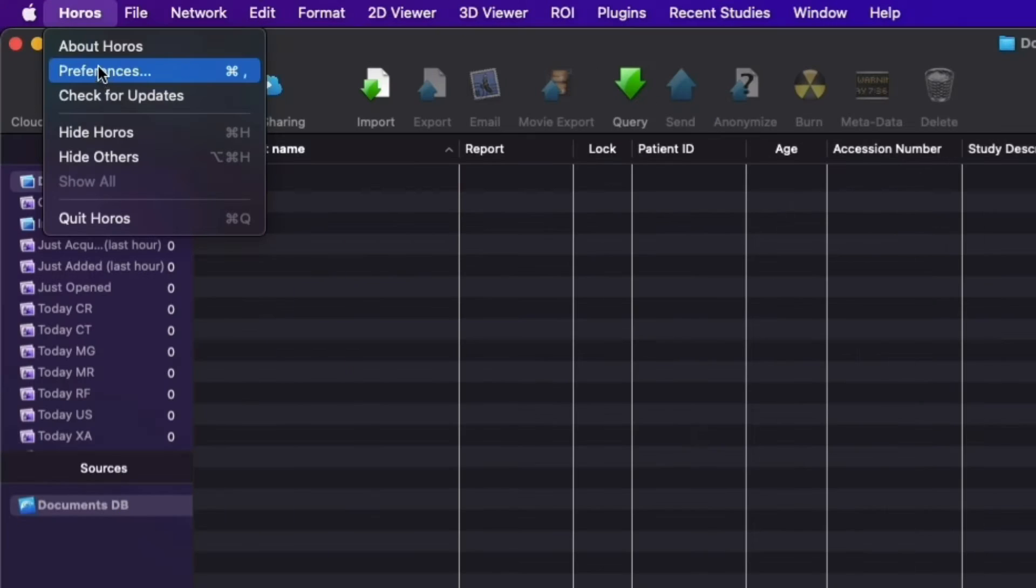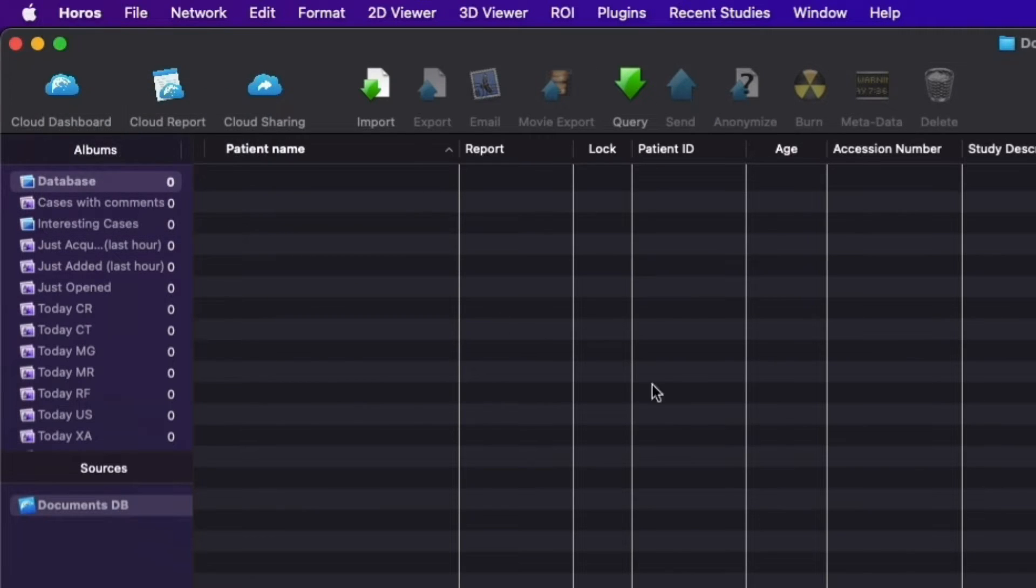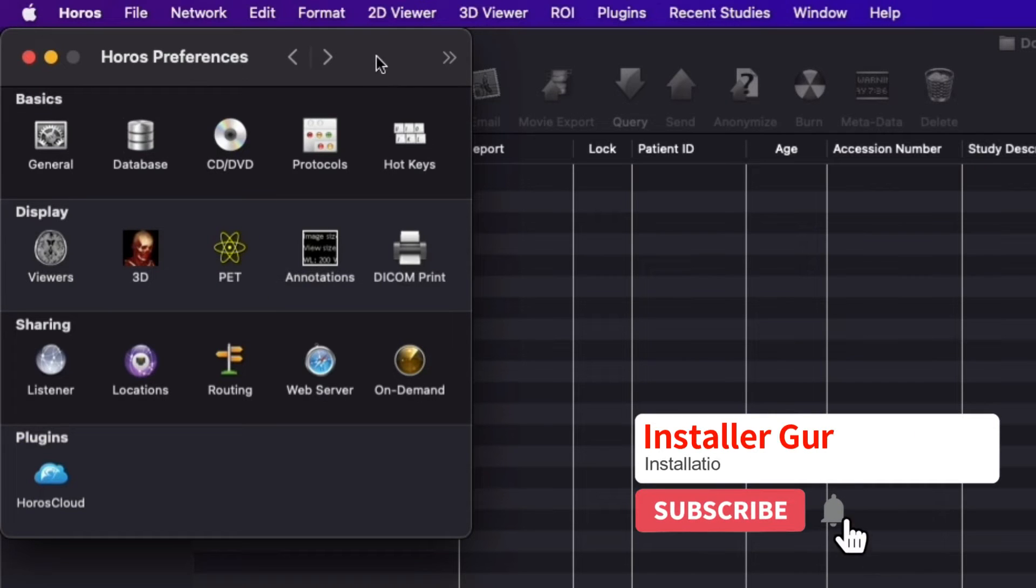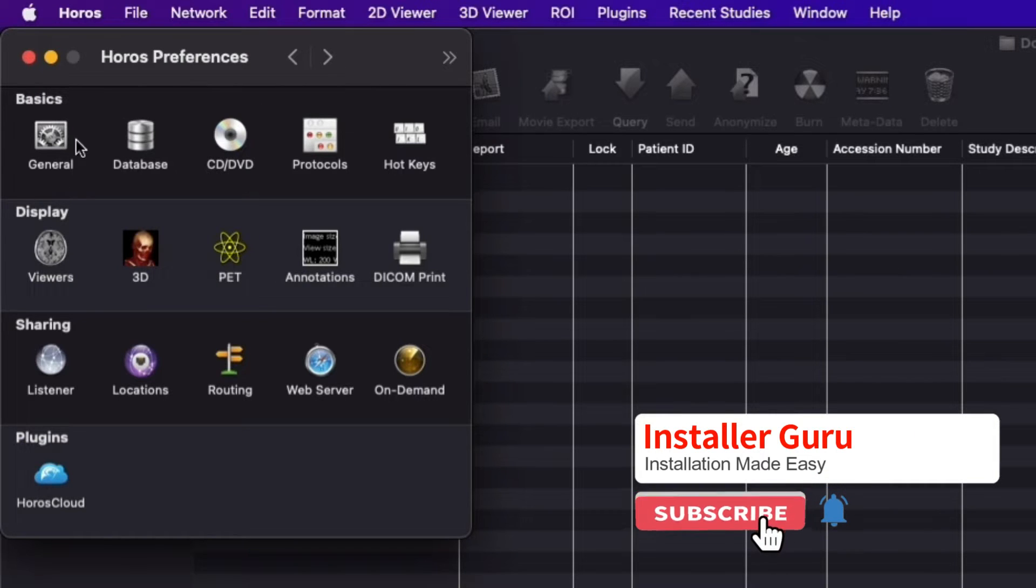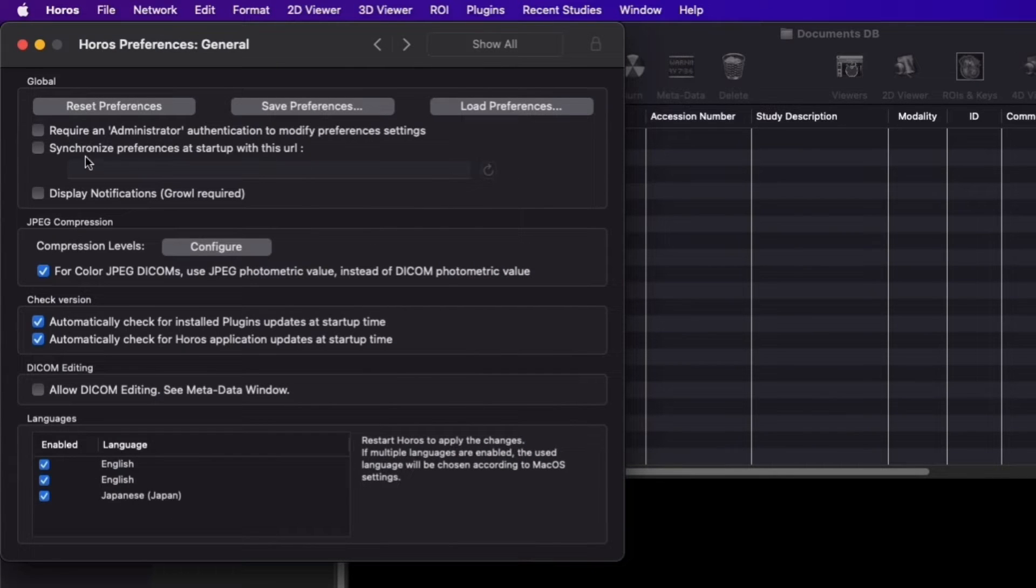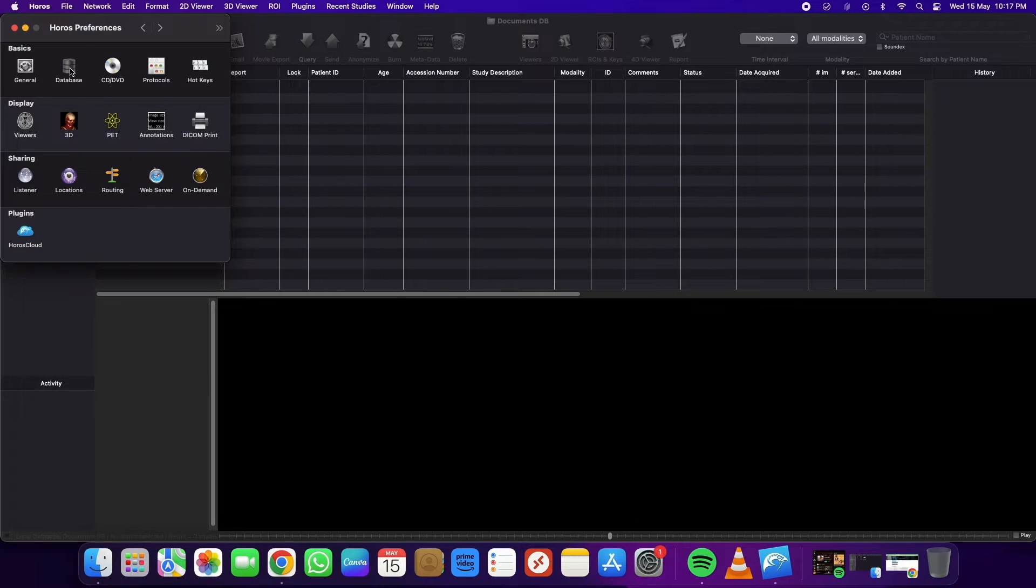Now let's go to the main settings, which are under Preferences. In this menu, you'll find all the major settings you need to understand first. In the general menu, you can adjust JPEG compression levels and language options.